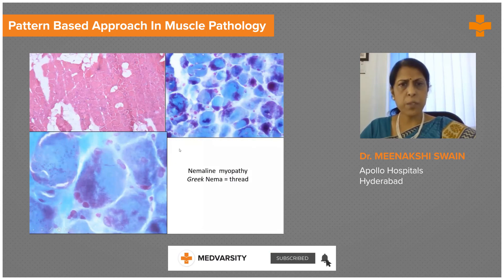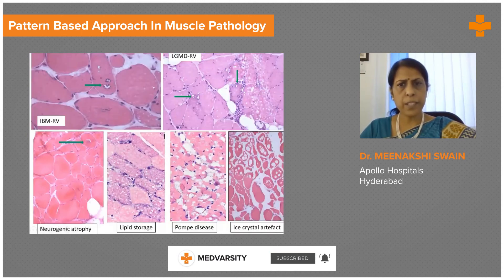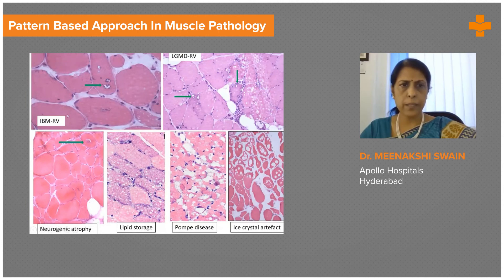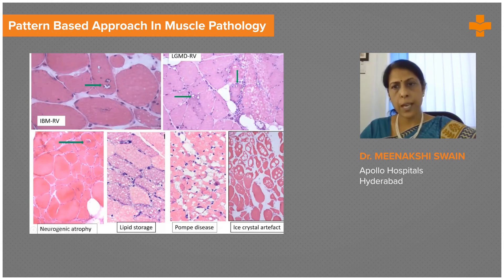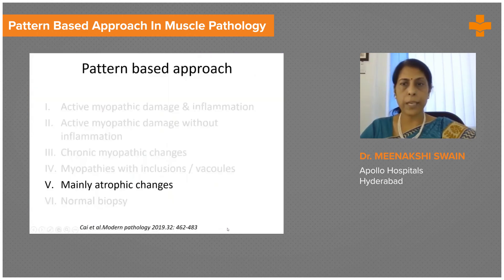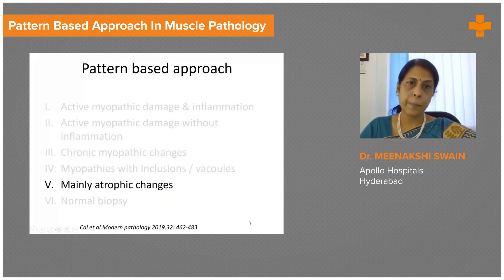This picture shows various types of vacuoles, which could range from inflammatory to dystrophies, to neurogenic atrophies, to storage disorders. The most common thing to keep in mind while looking at this group is a freeze artifact, which one needs to distinguish from true vacuoles in muscle disease.